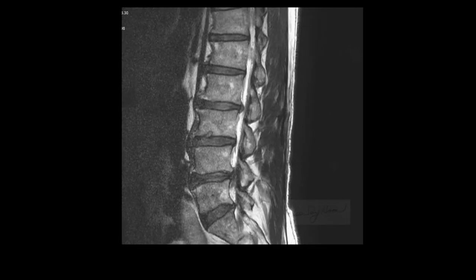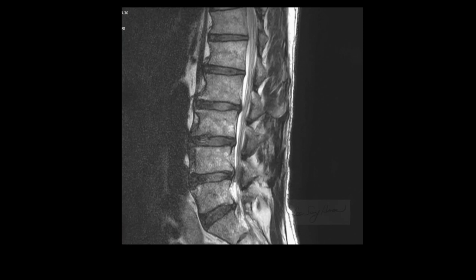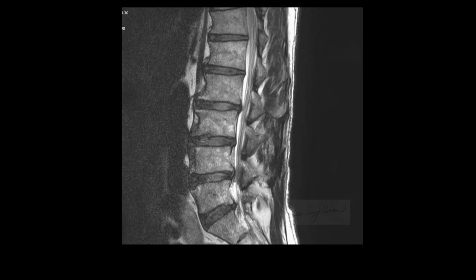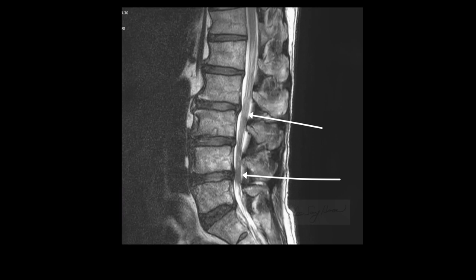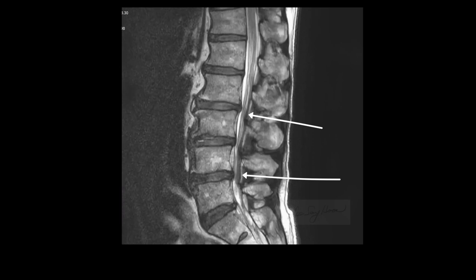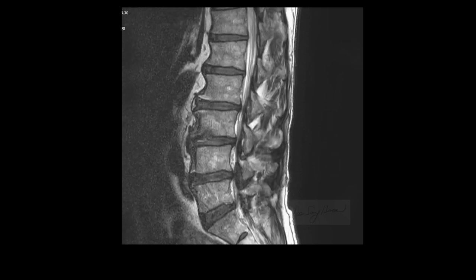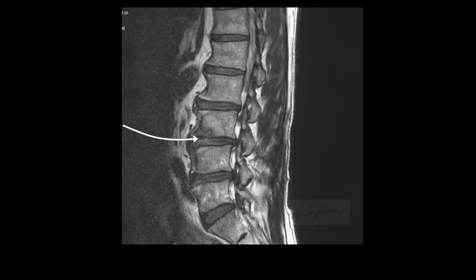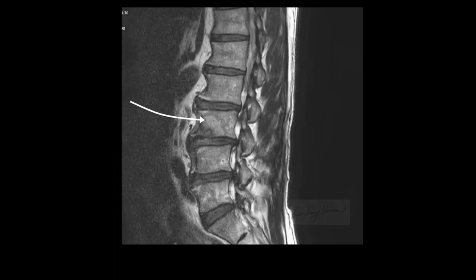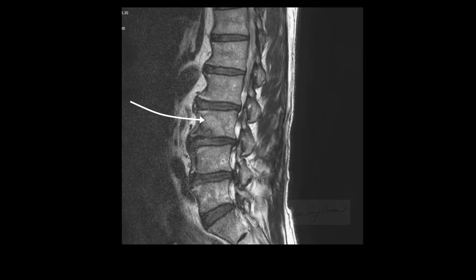I checked the lumbar MRI. This is a sagittal T2-weighted in-phase image. There are annular tears at L2-3 and L4-5 posterior central disc. There is a cortical disruption of the L3 inferior anterior end plate and increased bone marrow signal intensity of the L3 anterior body.